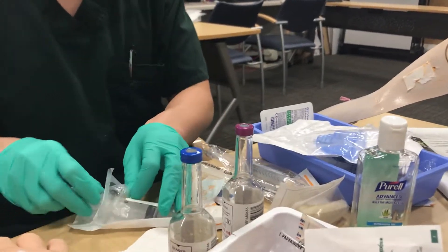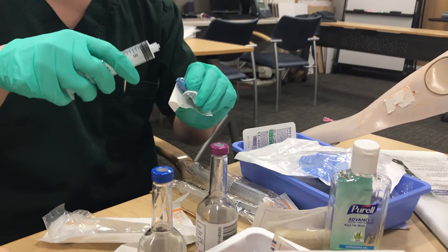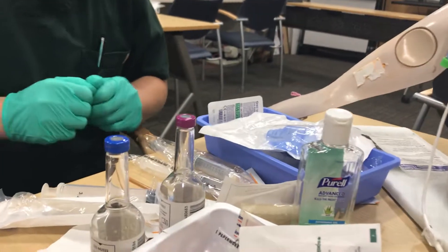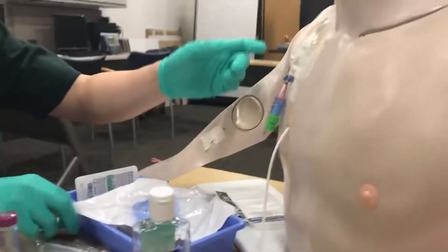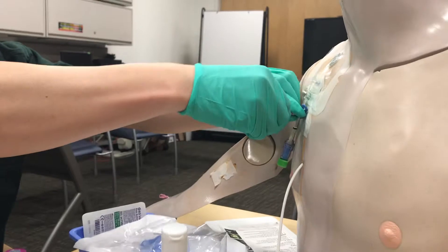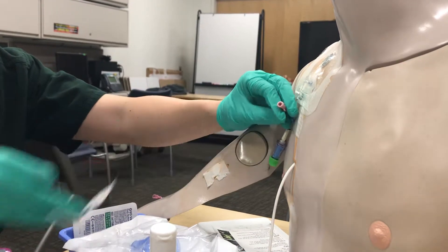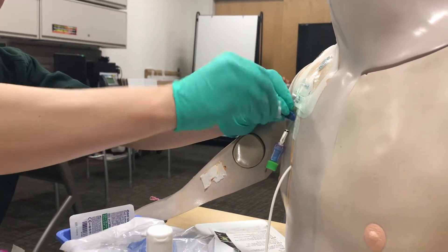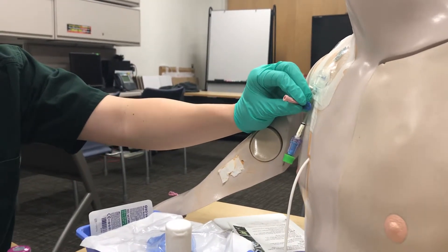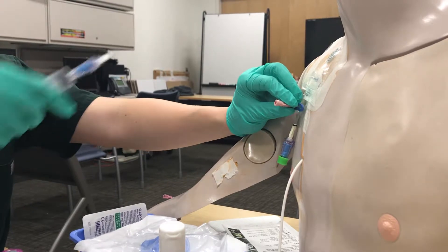Attach your 20 cc syringe to the cap by peeling it away, leaving the blue part exposed, attaching it, and setting it aside. Pick the port you're going to use, clamp it first, and go ahead and take off the cap. Scrub the site vigorously for 15 seconds and allow for dry time. It's very important that there is no waste here — you want to capture all the contaminants inside the catheter.